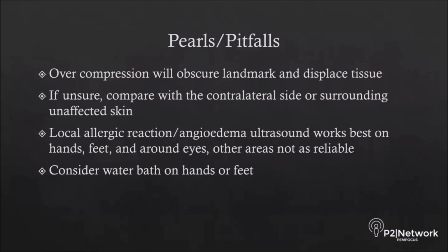Some pearls and pitfalls of this study: if you overcompress, if you press too hard, you will obscure the landmarks and displace the tissue. And if you're unsure, you compare to the contralateral side or the surrounding unaffected skin. For skin infections or local allergic reactions, sometimes you can consider using a water bath, and that especially works well for both the hands and the feet. And if you have local allergic reactions in angioedema, the ultrasound really works best to bring out the angioedema on the hands, feet, and the area surrounding the eyes.